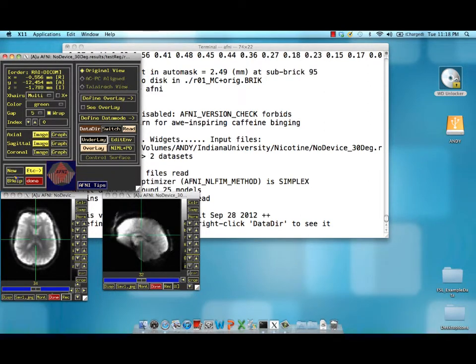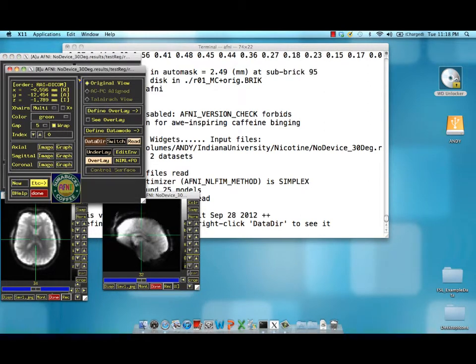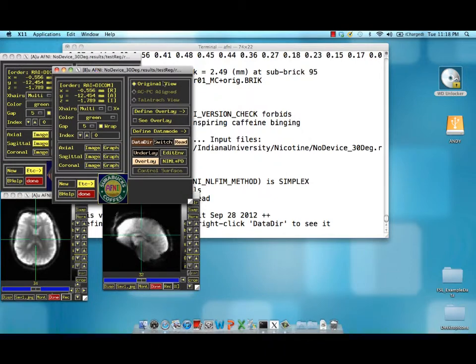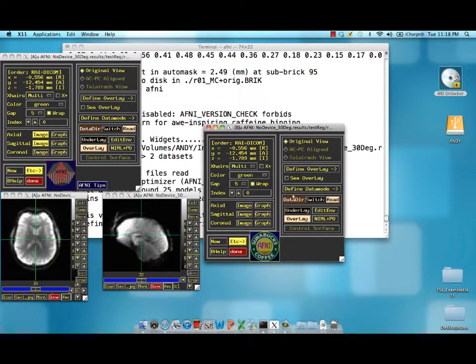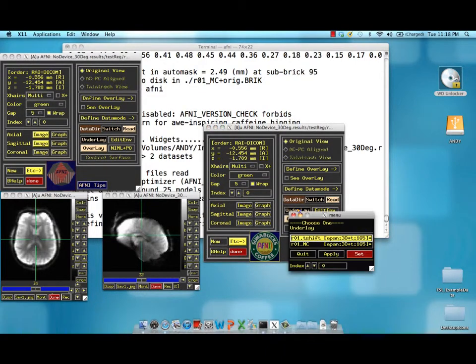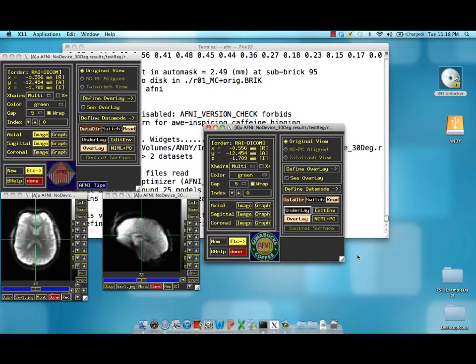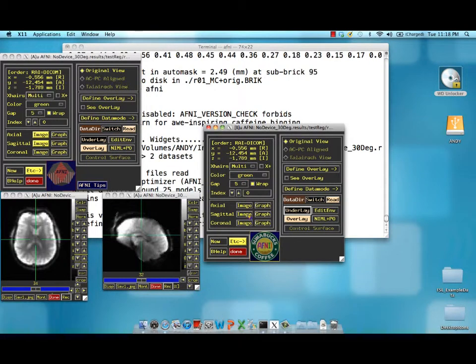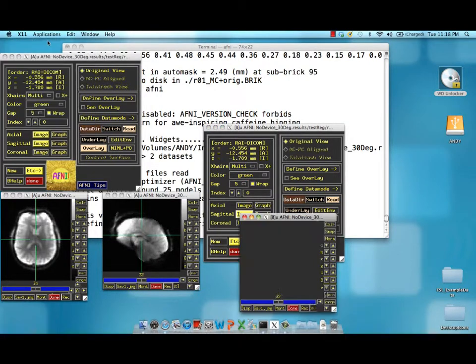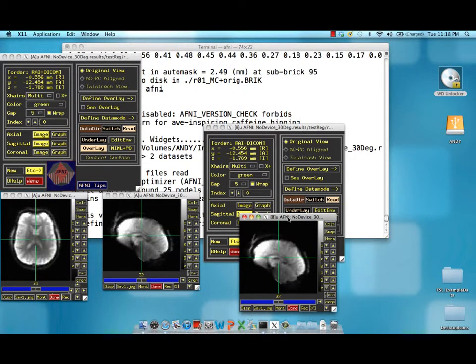And in another viewer, I'm going to open up our motion corrected data set. This will allow us to compare and see exactly what's happened with volume registration.